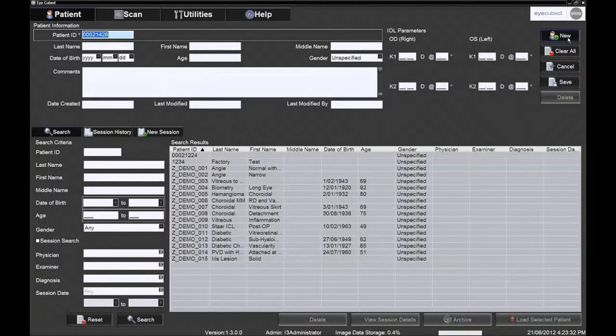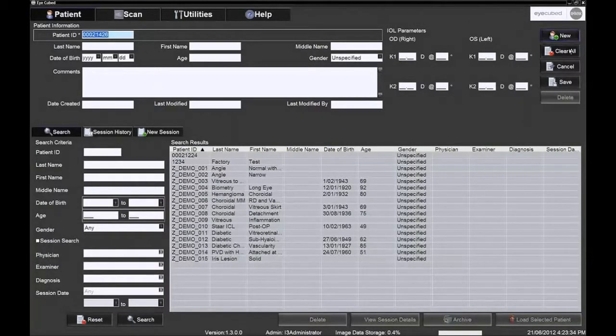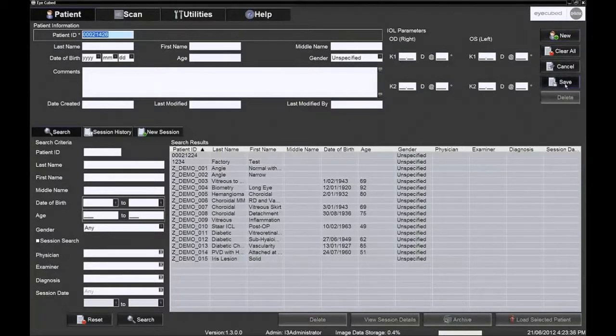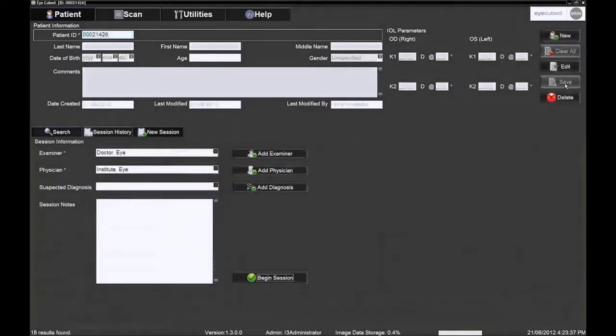The new patient data can then be entered followed by clicking save. Check that the patient information is complete on the summary screen.